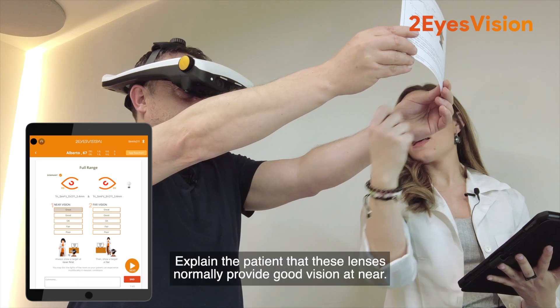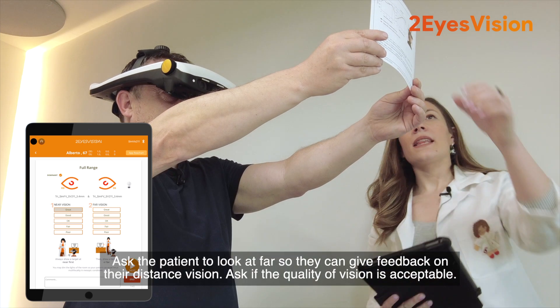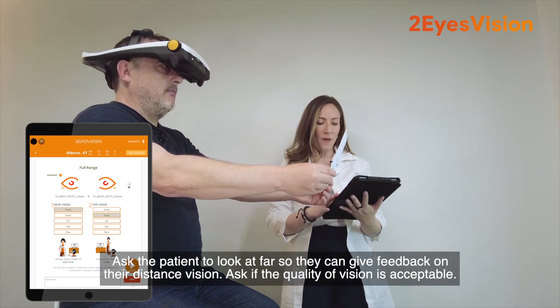Explain to the patient that these lenses normally provide good vision at near. Ask the patient to look at far so they can give feedback on their distance vision. Ask if the quality of vision is acceptable.